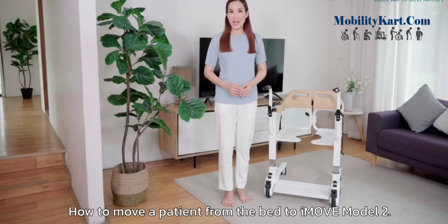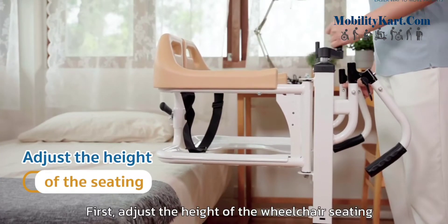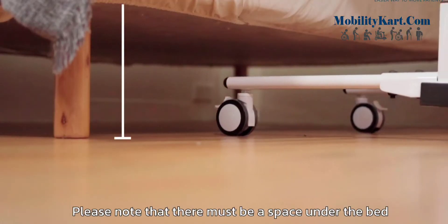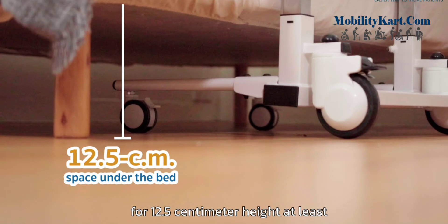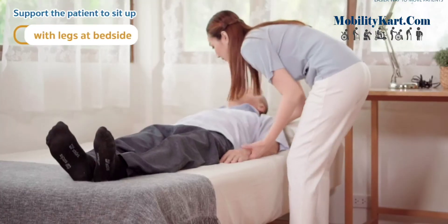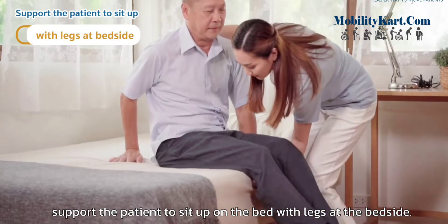How to move a patient from the bed to iMove Model 2. First, adjust the height of the wheelchair seating to the same level of the bed. Please note that there must be a space under the bed of at least 12.5 cm height for the best result when the wheelchair approaches and supports the patient. Next, support the patient to sit up on the bed with legs at the bedside.